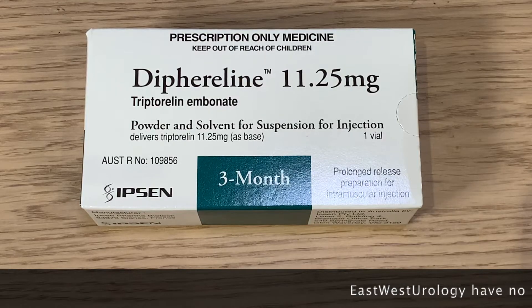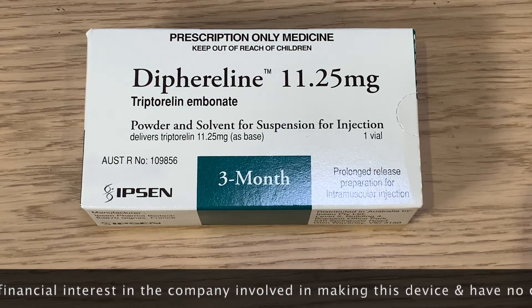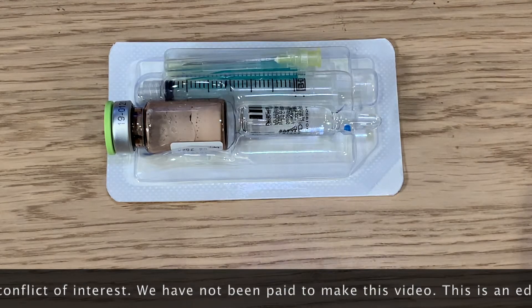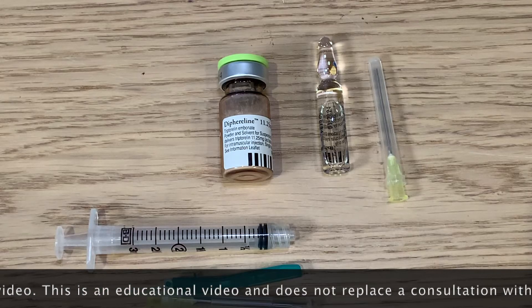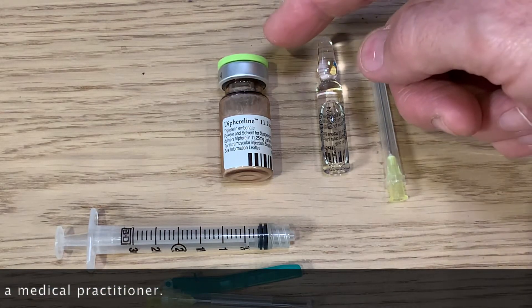The dipherulin three-month injection comes in a box. Once you open the box, the contents can be laid out on the table. It consists of two needles, one syringe, the dipherulin powder, and saline to mix.